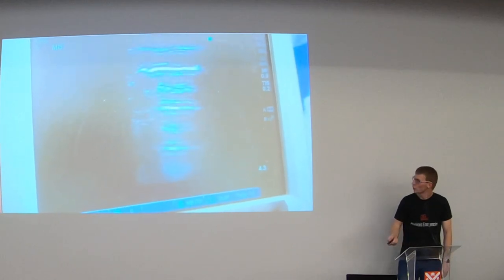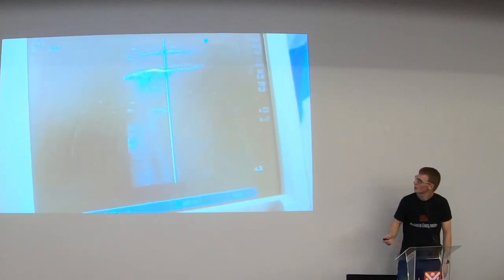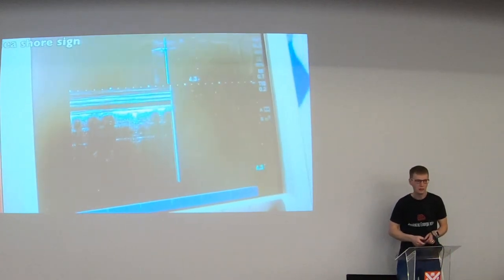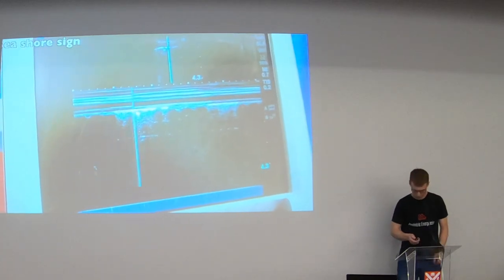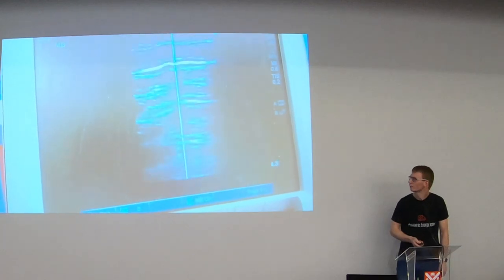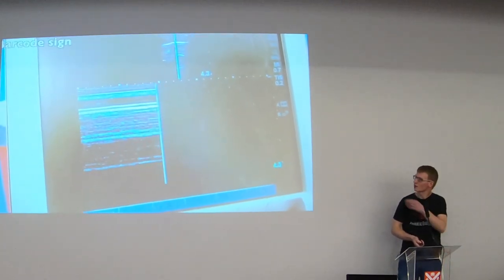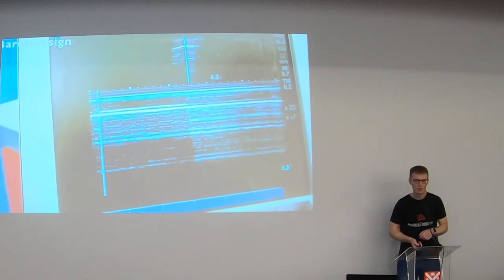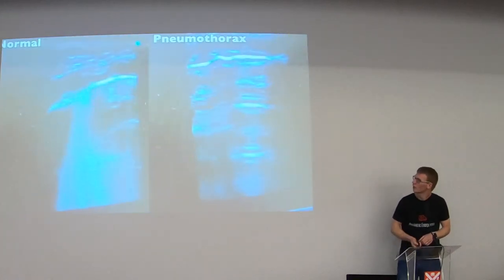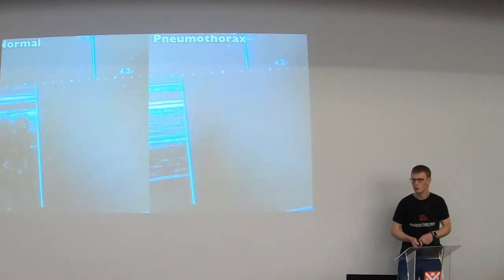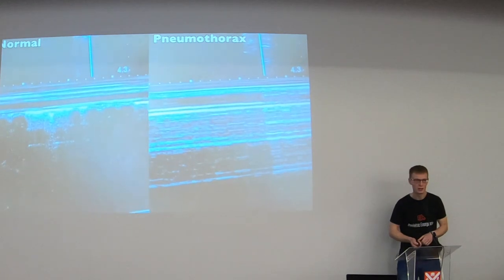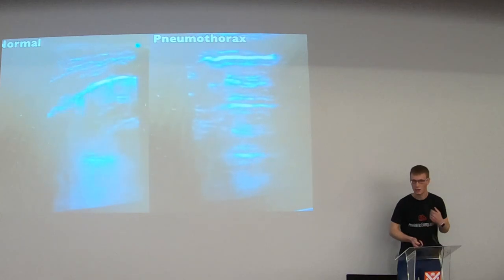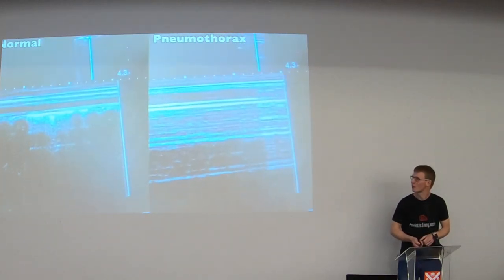And if you're not sure what you can do is put M-mode through it. So that's the normal lung. And in the normal lung you get what's called a seashore sign. So sea at the top, sandy beach down below. In a pneumothorax you get what's called a barcode sign. And it's due to all those mirror image artifacts you get this barcode type picture. I don't use M-mode myself. I just use the standard B-mode and I think it's fairly clear on that. When you look at the two together I think it's pretty obvious. And like I say this takes 10 seconds to do and you've got the ability to diagnose a pneumothorax out at the bed space. Really simple to do. If you're not doing it, pick up a probe and start scanning normal lungs. You'll very quickly be able to pick up what is abnormal.